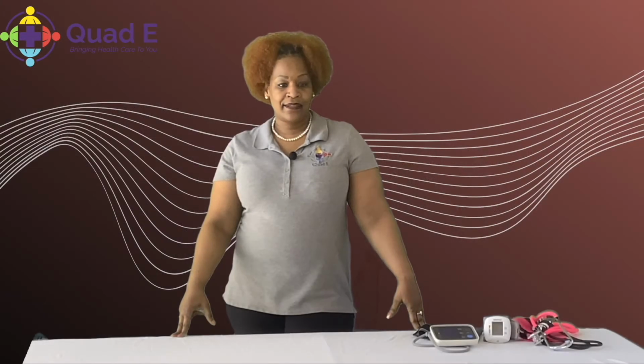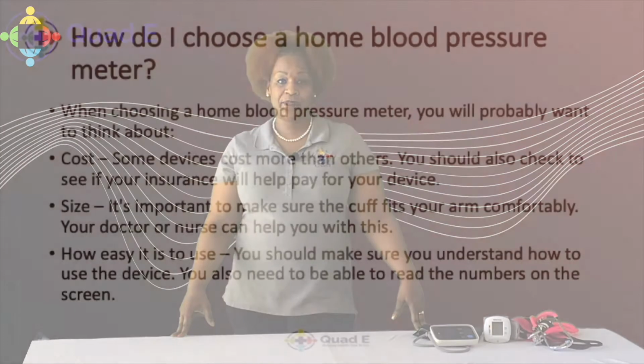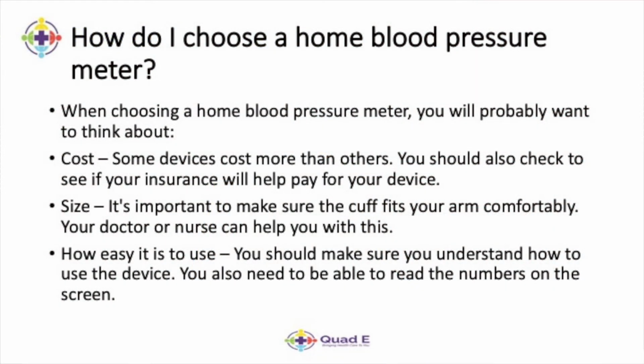The size is very important. Make sure that your blood pressure cuff fits your arm comfortably, okay? The doctor or nurse can help you with this. You want to make sure it's not too tight, because it's going to inflate, and you want a proper reading by not being overly small. And you want to make sure that you understand how to use the device, because all blood pressure devices come with instructions on how to use it and how to read the numbers.